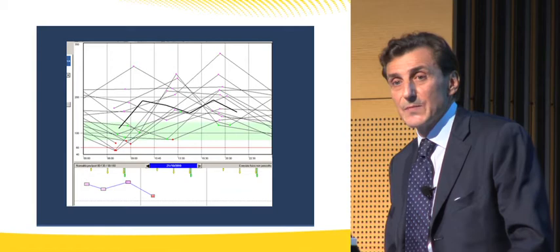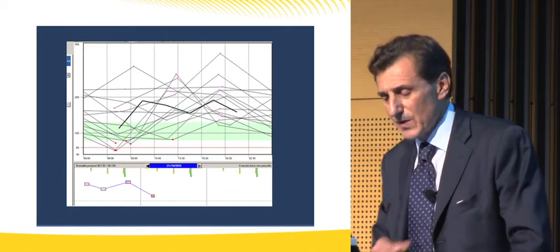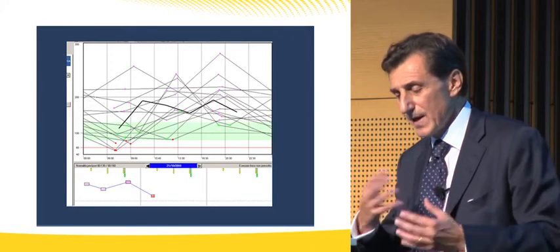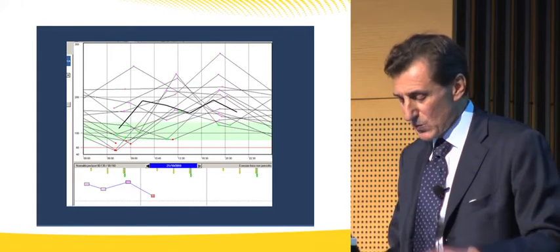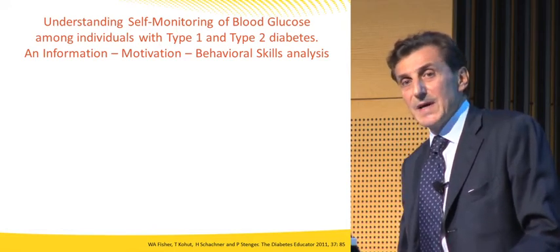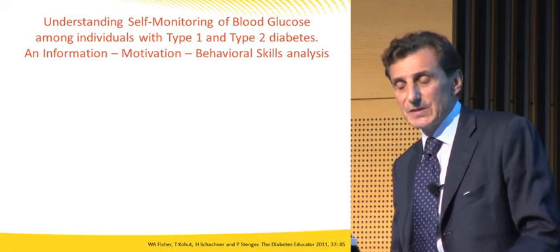Now we also have some software. This is the software I'm using in my clinic, and with this software we can improve our ability to understand the trends of our glucose. But we have to talk with the patient.